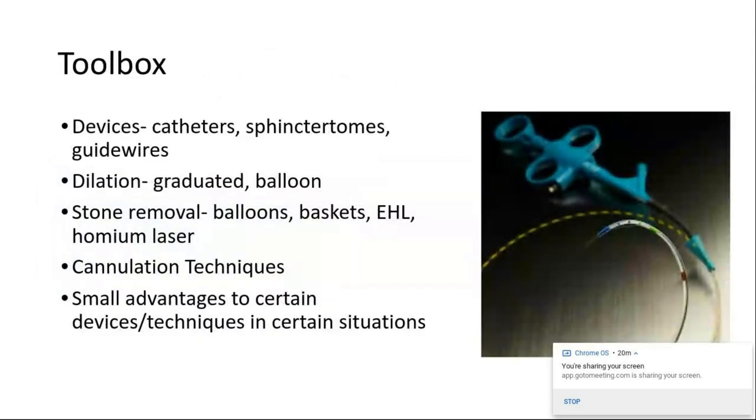You want to make sure you have a good understanding of what tools you can use. What are your devices? What devices do you have available for dilation? What are your options for stone removal? Also, what are some of the cannulation techniques that you're familiar with and you've had the most success for? And also making sure you understand that there's small advantages to certain devices and techniques in specific situations. Next slide.